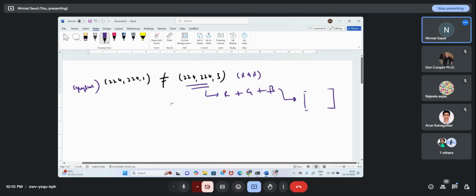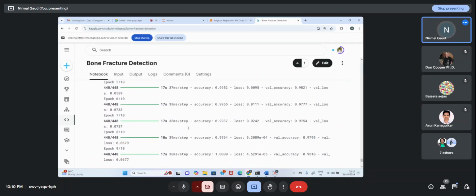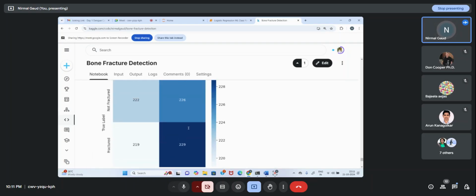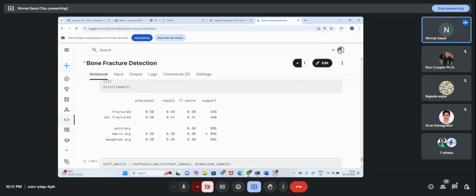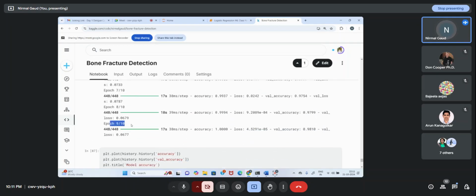Okay, that's a good question, and I decided to take this RGB. I trained my model, and you can see the training. See, I took the same architecture. Previously, on the same architecture, I only went for how many epochs? I went for 7 epochs, 99% accuracy. This is the value. Now I went for how much? Till 9 epochs, 100% accuracy. Validation 98. Okay, fine, doesn't matter.